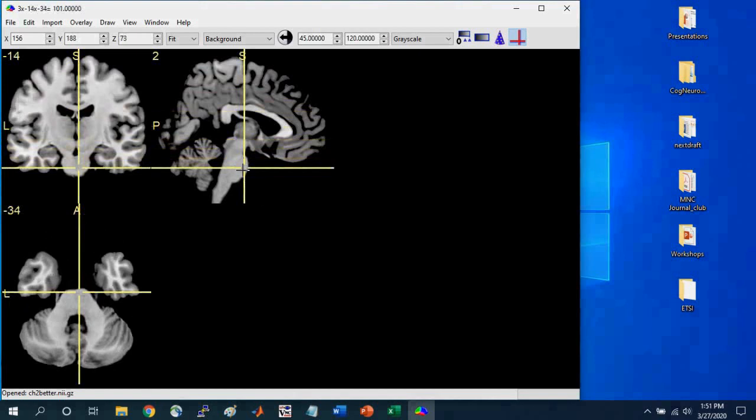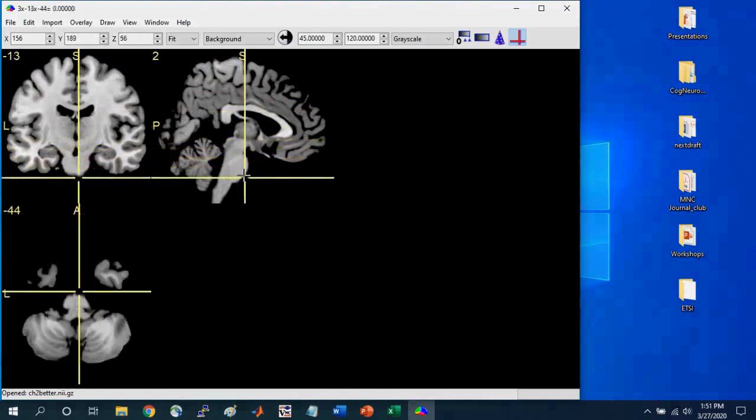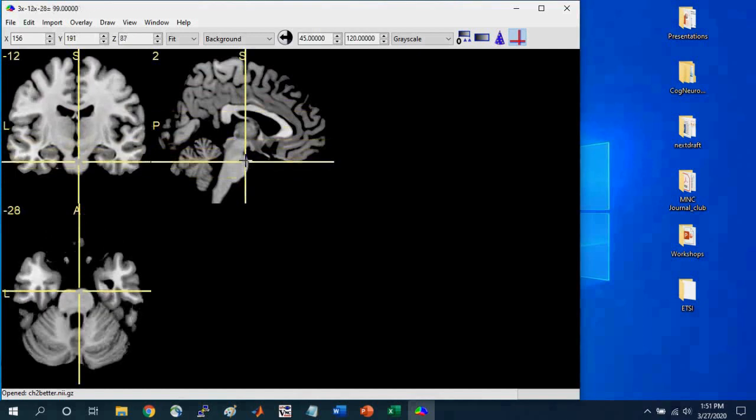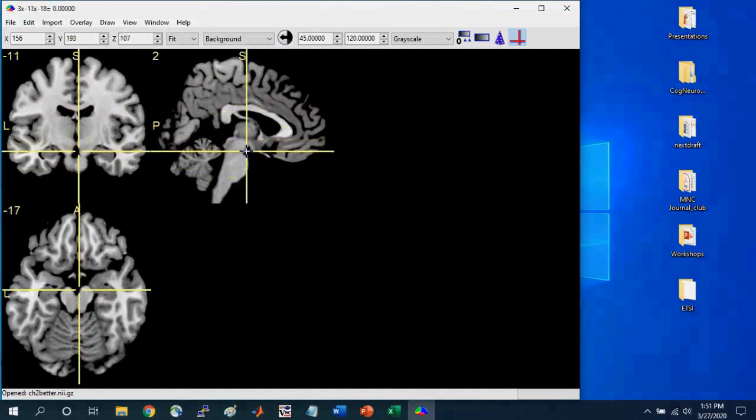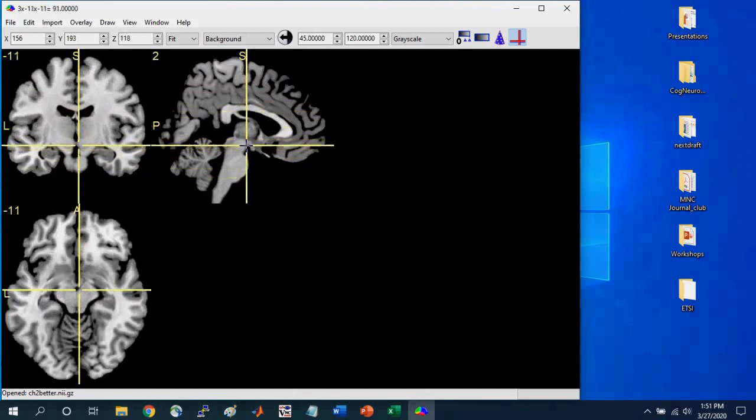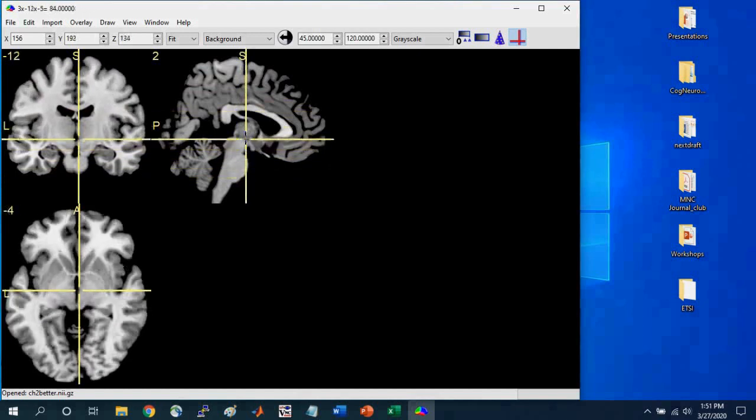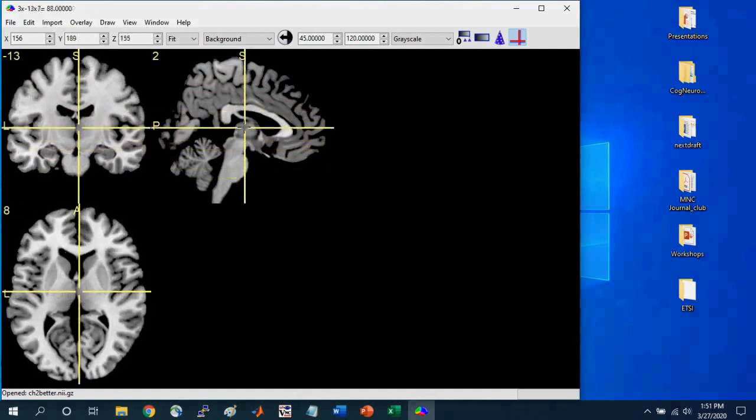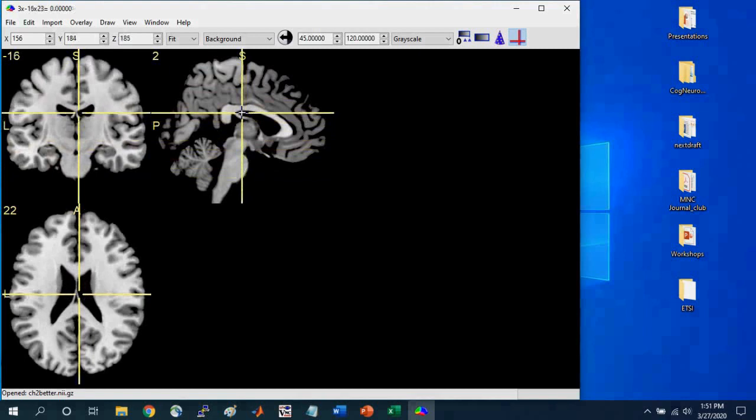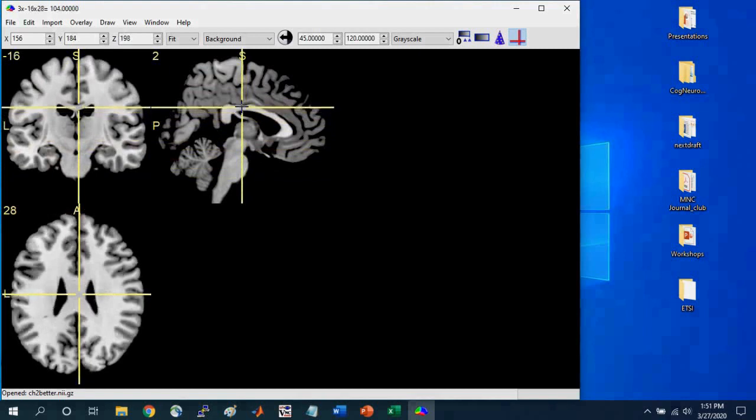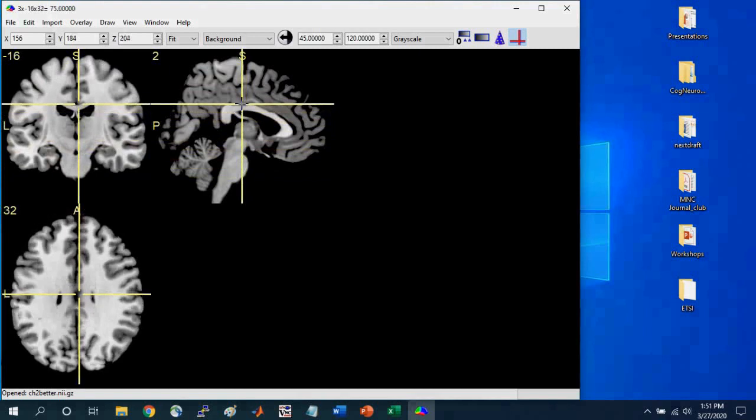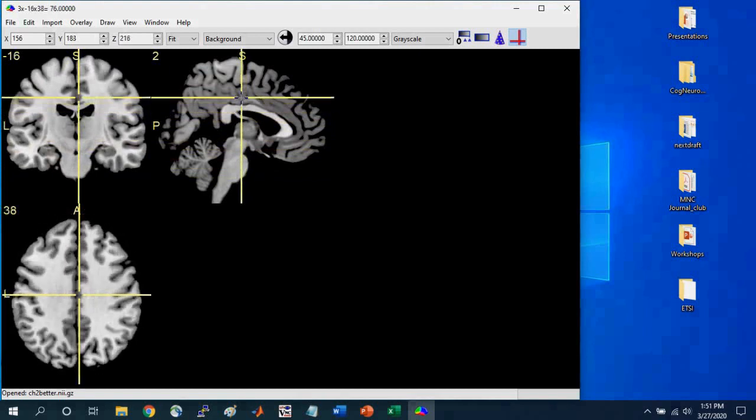And so now I'm going more superiorly. And so this gives a kind of surfing through the brain in one particular orientation, okay?